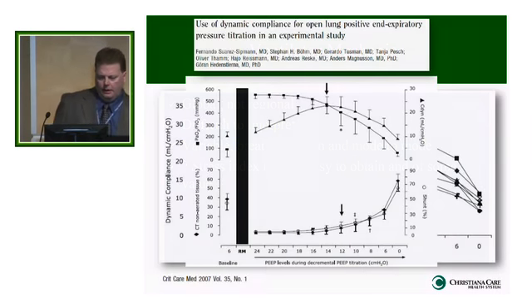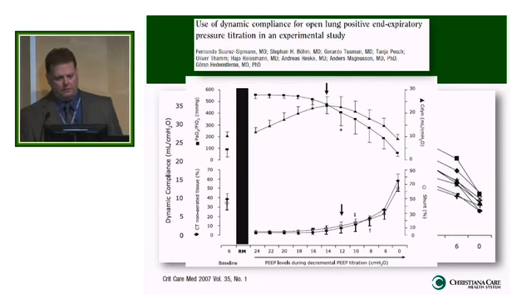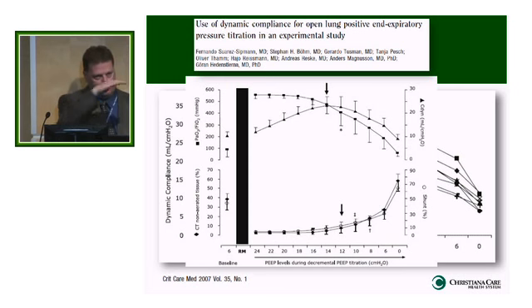I'll mention the mechanics a little more. If you use the ventilator mechanics in your decremental PEEP trial, so this is mixing decremental PEEP trial with looking at the compliance of the patient. Look at that nice bell curve there. So you'd say, well, right in here is a sweet spot where most of these patients are most compliant on their decremental PEEP trial, and guess what? It's right around 15 of PEEP. It's also at the same point, and this is a busy slide, where the oxygenation is good but just starting to get bad, just starting to turn downward, and where shunt is just starting to turn upward on the bottom of the slide, and where non-aerated alveoli are really starting to open up.